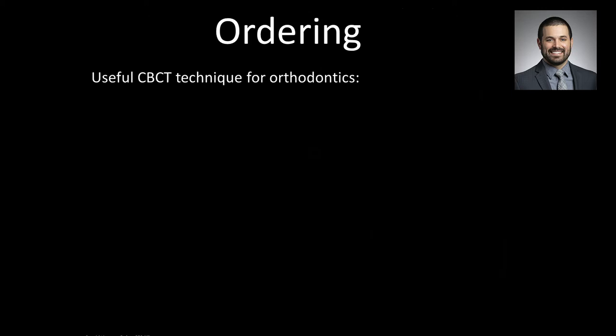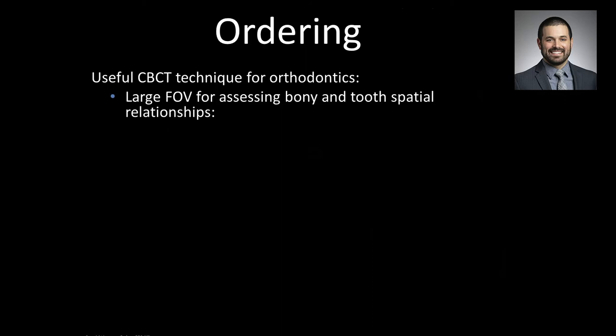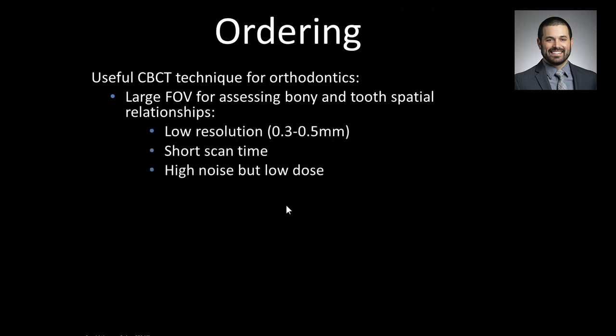Let's look at cone beam CT technique for orthodontics. There's really two common approaches. The first one is a large field of view for generally assessing the bony and tooth spatial relationships of your patient. We're going to pick a fairly low resolution, anywhere from 0.3 to 0.5 millimeters, and a shorter scan time, 5 to 10 seconds. We're going to get high noise from that, but a quite low dose.